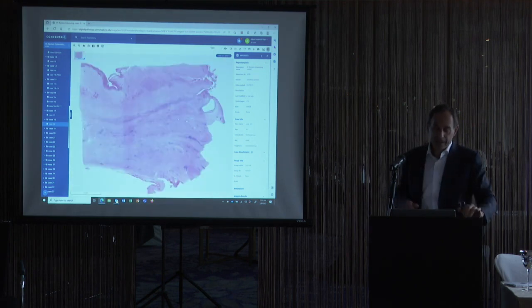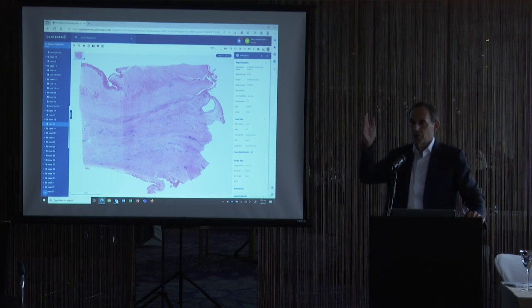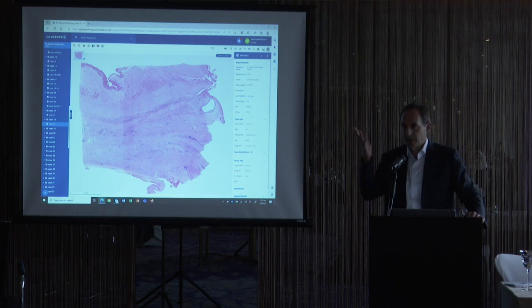Right. So it's a tricky area in bladder. When you have invasive cancer, you should try to give the clinician some indication as to the extent of invasive cancer. There's no uniformly accepted way to do that. Sometimes if I can say it's above the muscularis mucosa versus below the muscularis mucosa, I'll do so. But sometimes you can't make out where the muscularis mucosa is. There are sometimes when it's just very focal, I'll say focal invasive cancer. There are sometimes when it's extensive, and I'll say extensive to try to sensitize the clinician to that.